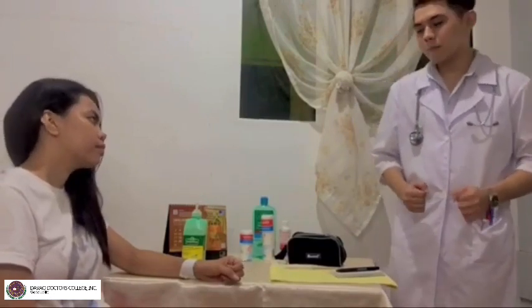This is for the patients to lessen anxiety and promote cooperation. I also need to verify the client's identity because I need to ensure the care is being rendered to the correct client. I have explained the procedure to her a while ago, and explaining this procedure to the client can reduce the client's anxiety and enhance cooperation. Now I need to perform hand hygiene or hand washing and observe appropriate infection prevention procedures.